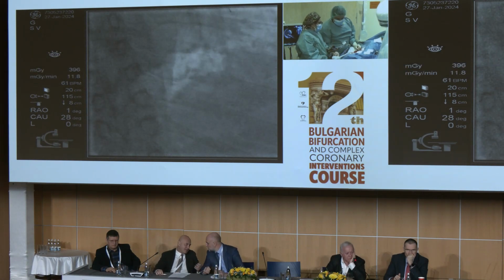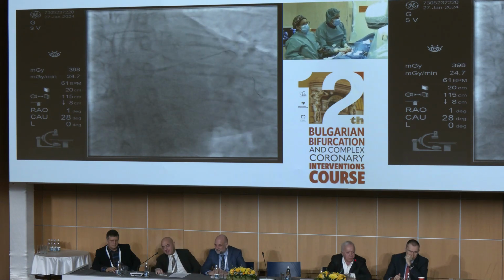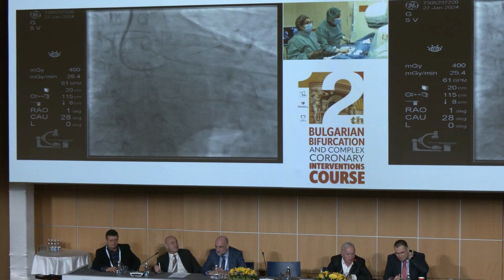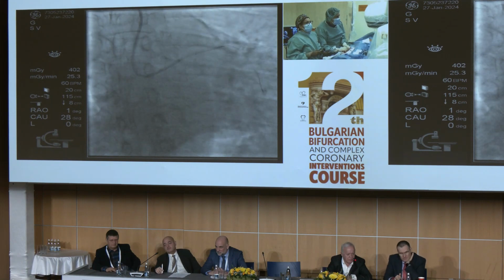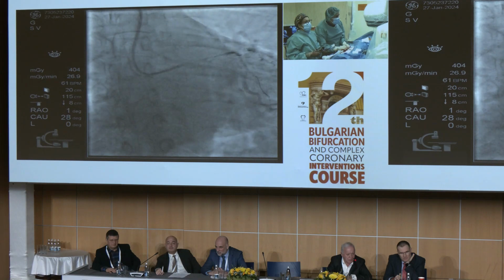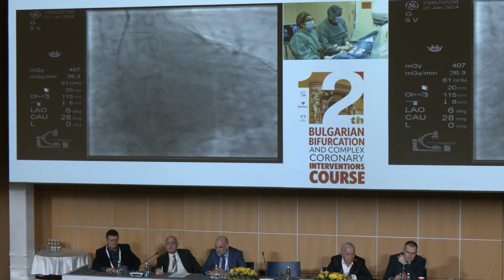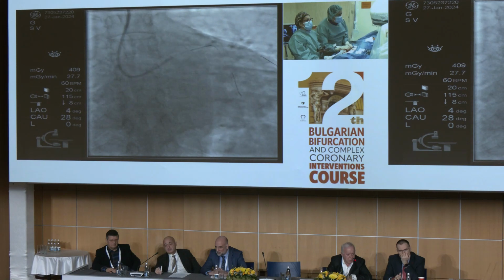And now we can test here, because sometimes... Take care not to move. Let's engage a bit better to get more stability. Test again. So you were right. A small test. This will be enough, I think, because we are confident that we can deploy here.